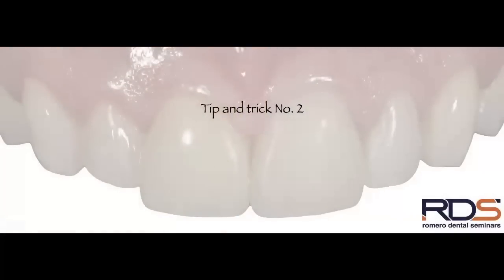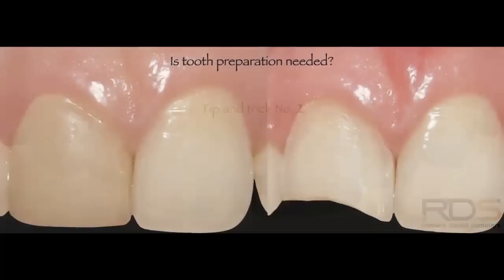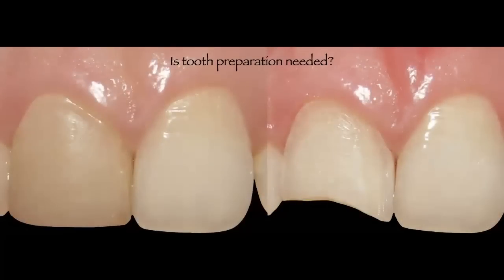So what is our tip and trick number two? Our tip and trick number two is to answer this question: is tooth preparation needed? Now, you will find some cases where tooth preparation is needed, like in the case that I'm presenting you right here. This is the same case as previously stated. You can see that the patient had a restoration, a composite veneer on tooth number 8. This composite veneer was fabricated or was delivered to the patient due to this fracture that you are seeing here on the right-hand side of my screen.